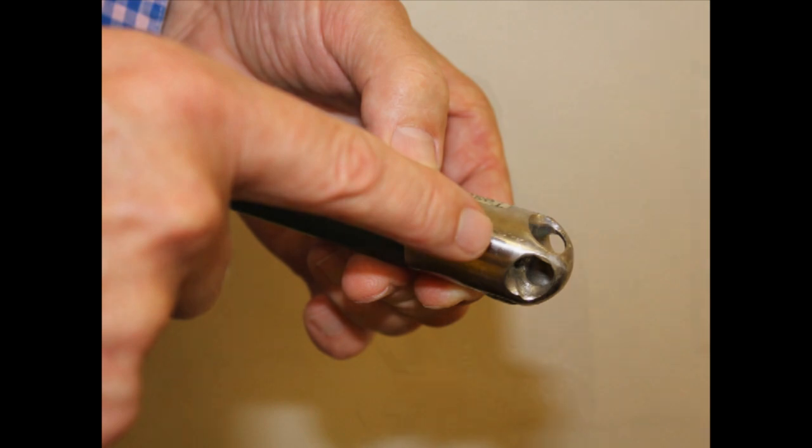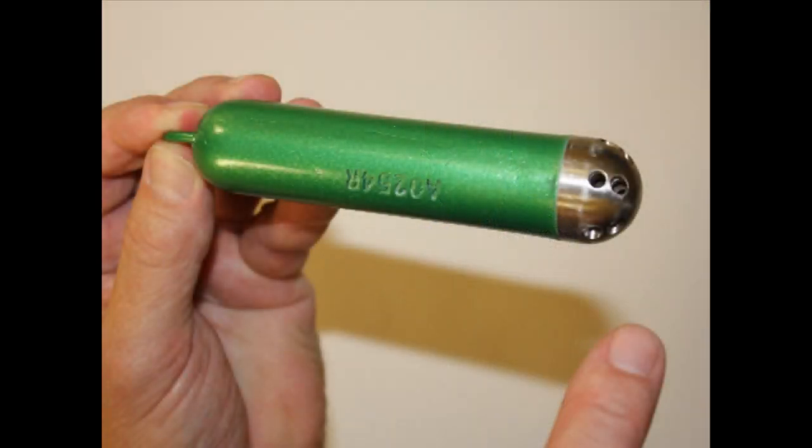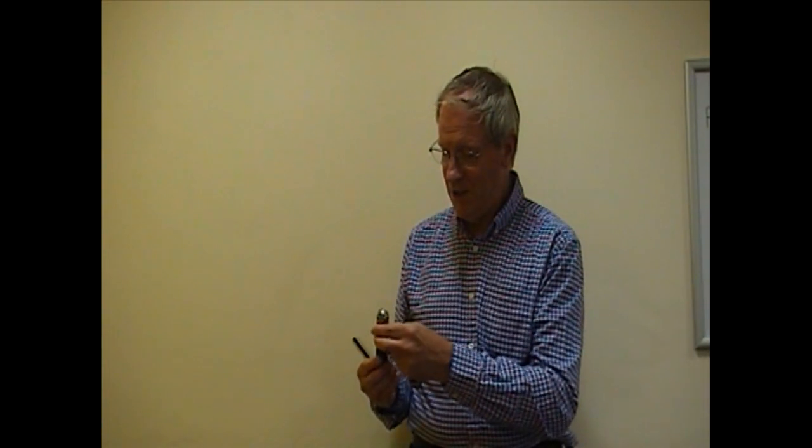This worked okay, but what happened was that the cow is full of stones and bits and pieces, and the stones would force their way against the sensor and break it and cause the pH measurement to be incorrect. So we came up with a different method where we have lots of small holes, and we make sure that the sensor isn't directly accessible by stones, so that any stones get forced past it rather than onto it. So all engineers who try and develop boluses have this problem with managing their sensors.